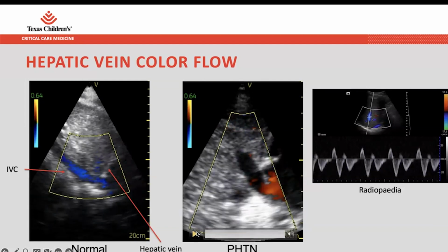So that is blood being regurgitated up through this distended hepatic vein. IVC is over here. This would be a situation consistent with what you would see in a fluid overload VExUS patient with a hepatic vein score in the severe category.